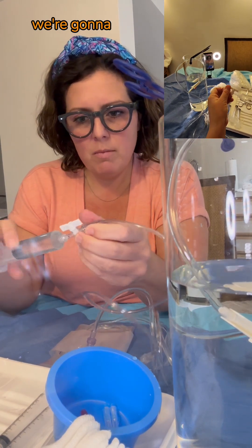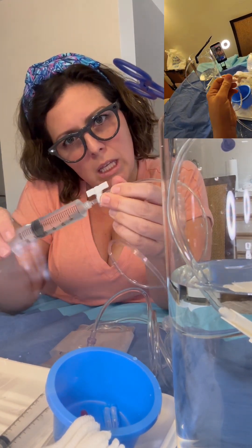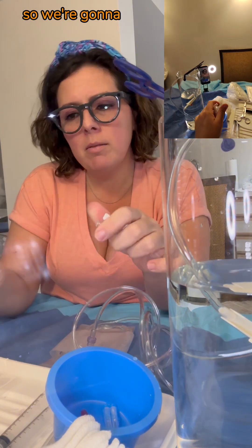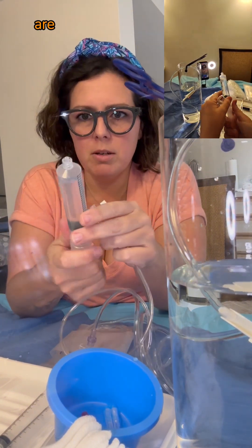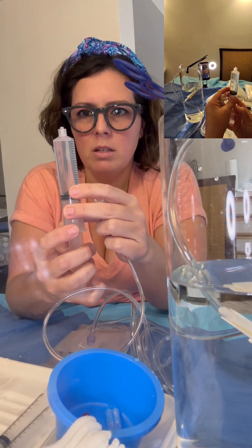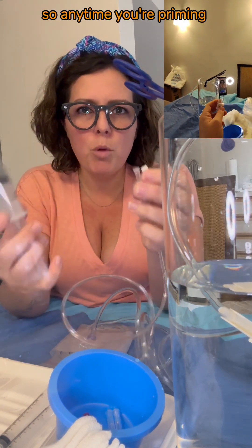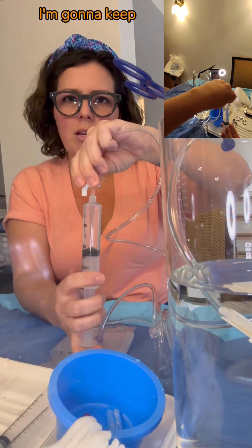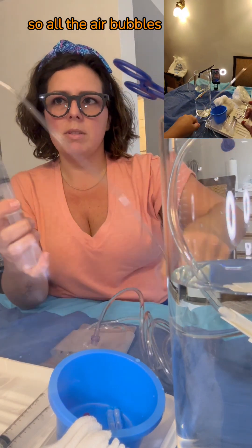We've got our one-way on. We're going to prime our tubing. When you prime it, you want to make sure there's no air bubbles. So we're going to make sure all the air bubbles are out of our big syringe. Air bubbles rise, so anytime you're priming something, bring it up. I'm going to keep my syringe pointing up so all the air bubbles come out.